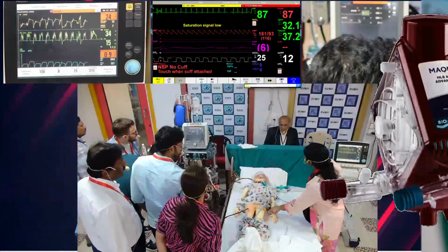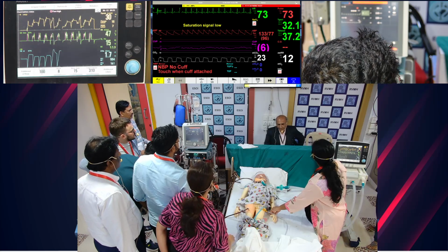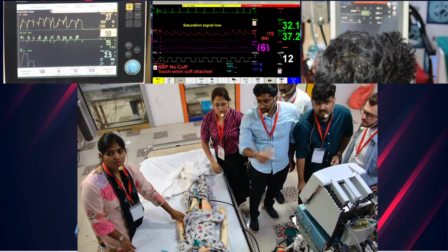Check for any air or anything. Hypoperfusion, I think. I don't see saturations. What's the temperature? Temperature is 37. The patient is ending up in bradycardia. So I want to give one more fluid bolus.